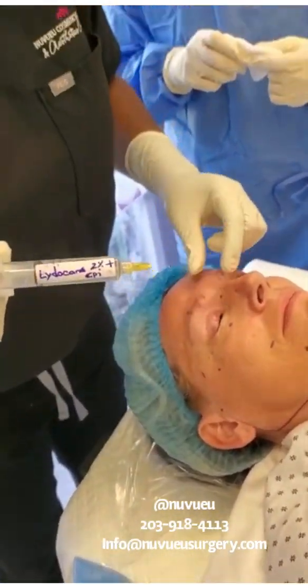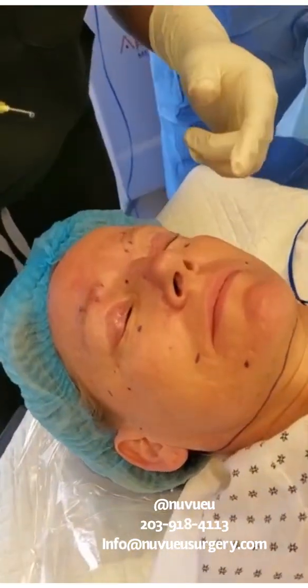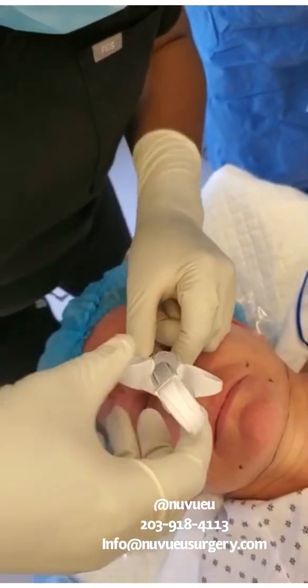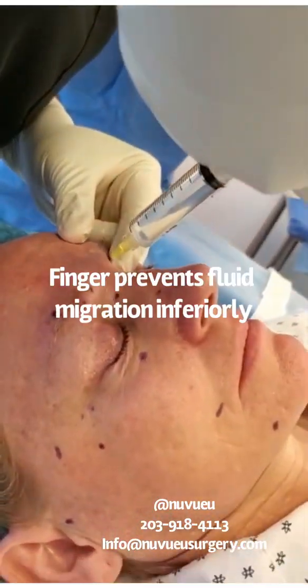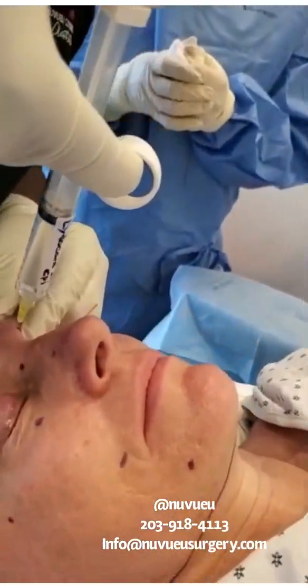Okay, that's that. We're going to go to the other side. Put your finger on the orbit to prevent the fluid from going downstream. We're going to go to the notch, which is right there. Then you want to aspirate to make sure you're not in a vessel. Finger over, and you want to put in one full cc.